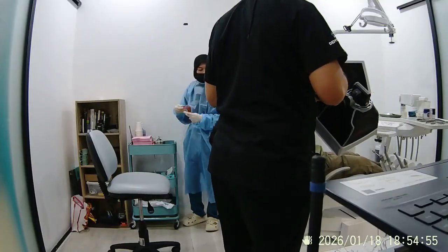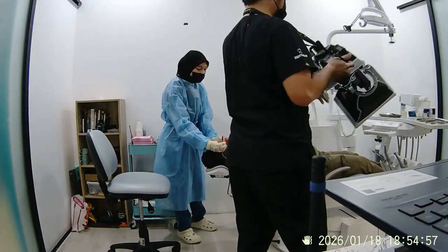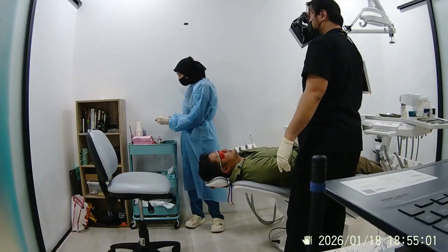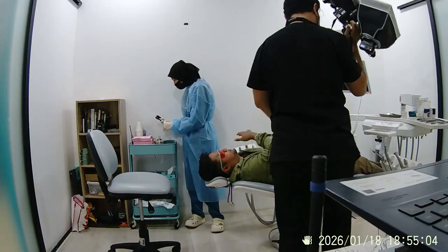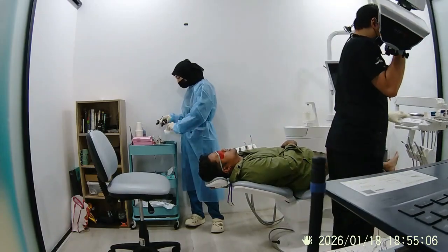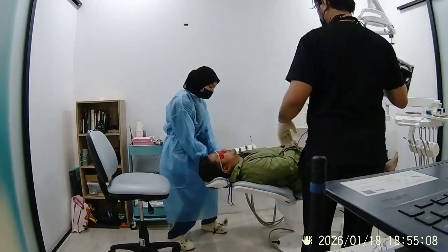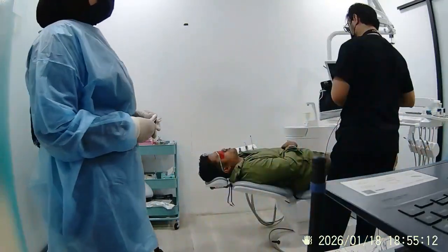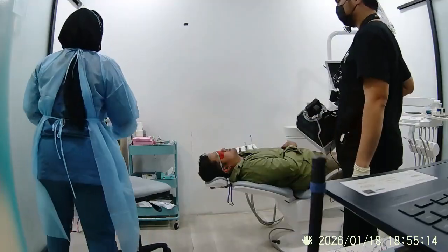So more or less, we can know for sure whether the patient is a good candidate for an extraction or non-extraction approach. For this patient, we already took his X-ray records beforehand, and in this edited video, we are only showing the photography and the final treatment plan discussion.